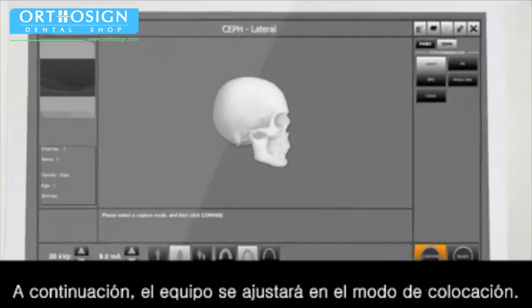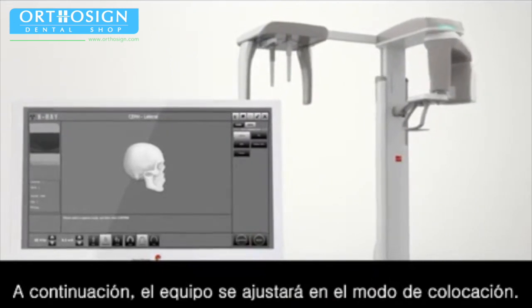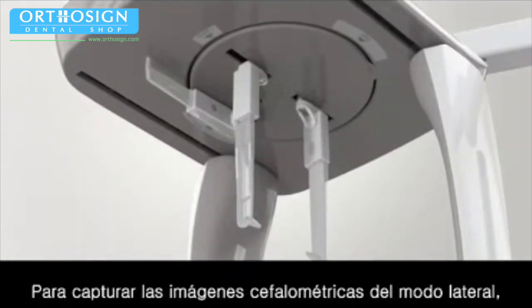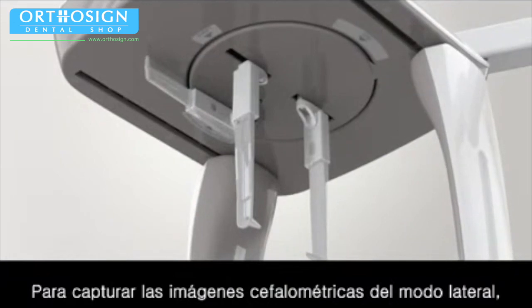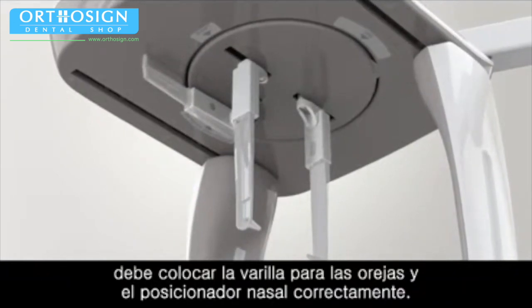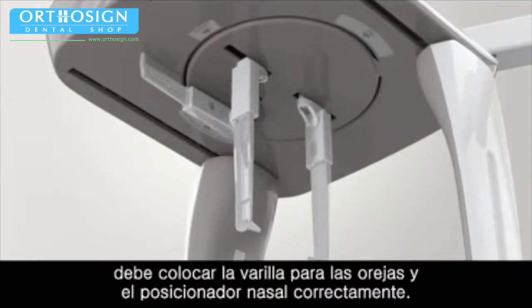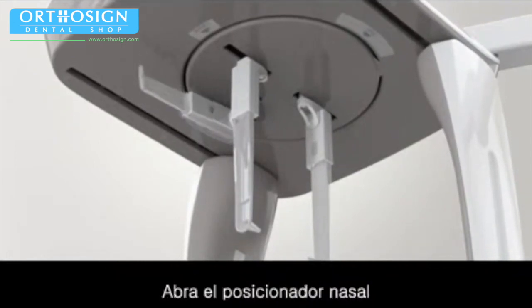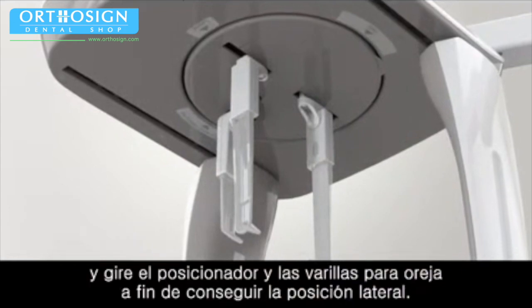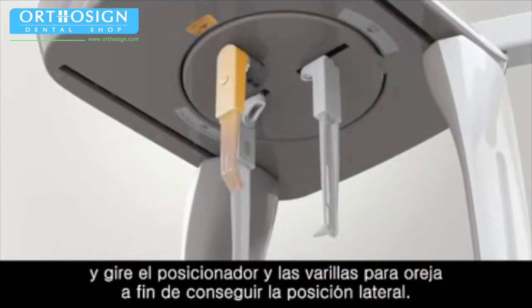Then the equipment will be set in positioning mode. To take the Ceph images of the lateral mode, you have to locate the ear rod and nasal positioner in the proper position. Unfold the nasal positioner down and turn the ear rod to locate the lateral position.